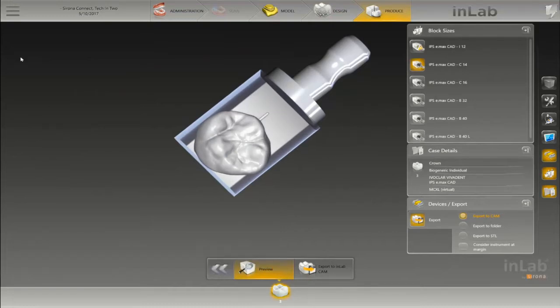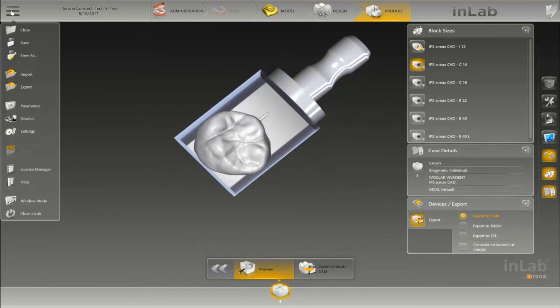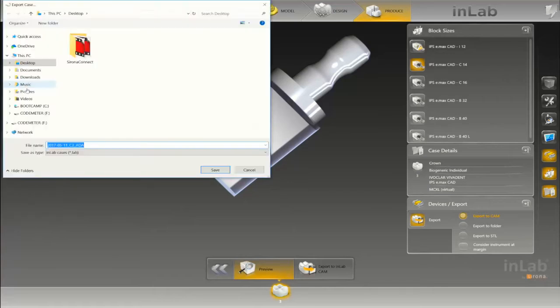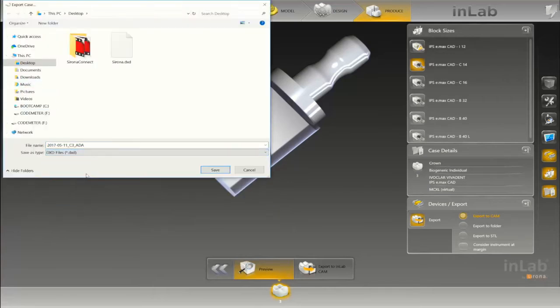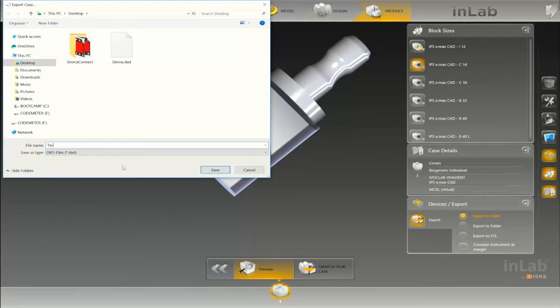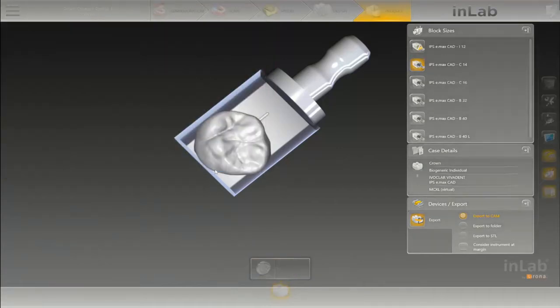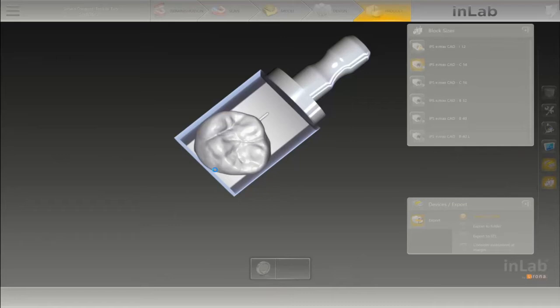In the produce stage, we export and save it as a DXD. We name it, include the patient's name if we want, and always save it to your desktop so you can find it easily.